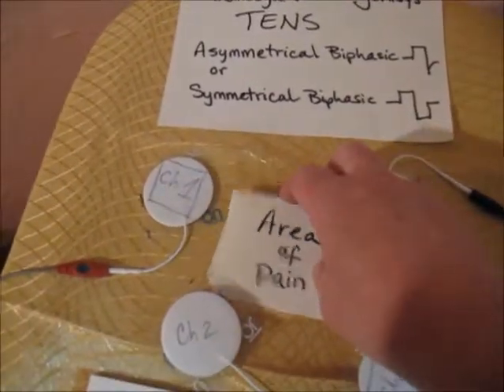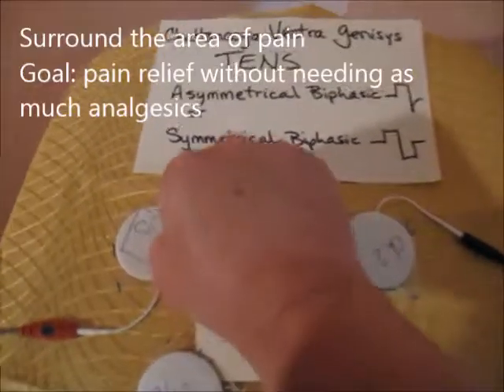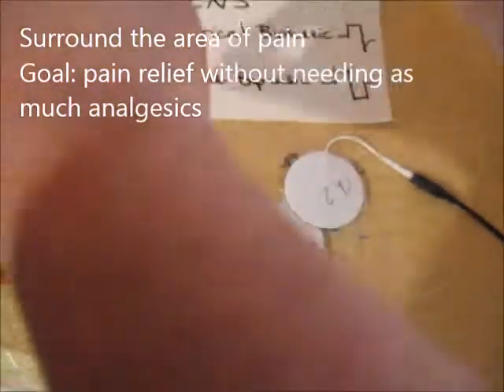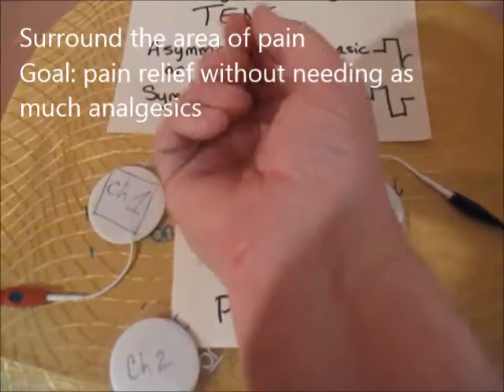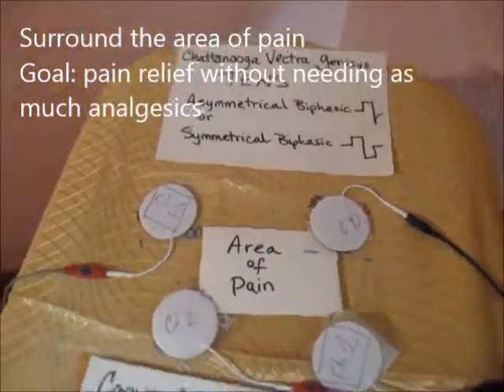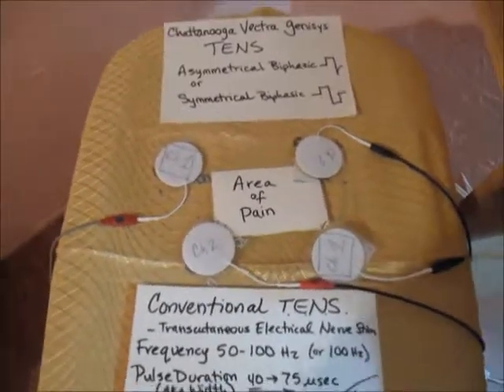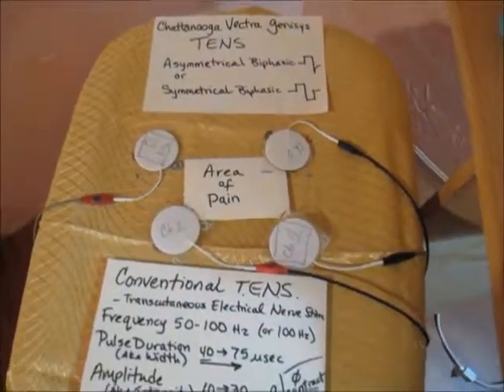Surround the area of pain — if this were your wrist, put pads around the wrist; whatever hurts, the knee, etc. The goal is pain relief without medication.